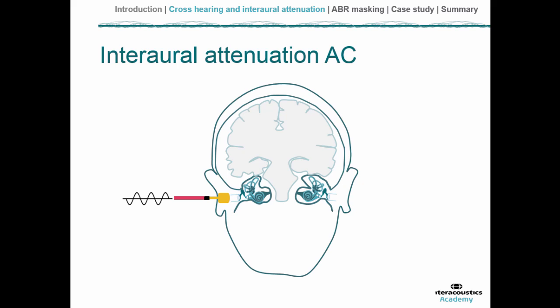Similarly, if we had, for example, a supraaural headphone, the same thing could happen in that sounds would pass down the normal air conduction route, but at some point, with the sound intensity high enough, the contact of the transducer to the side of the head would be expected to set the bones of the skull in motion and send sound vibrations across also.